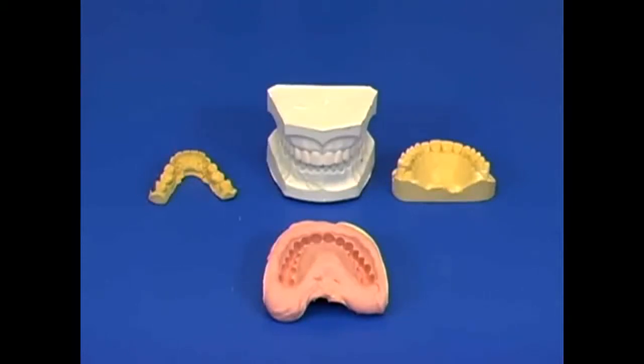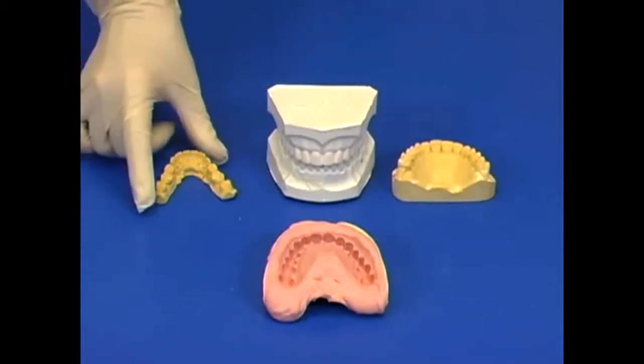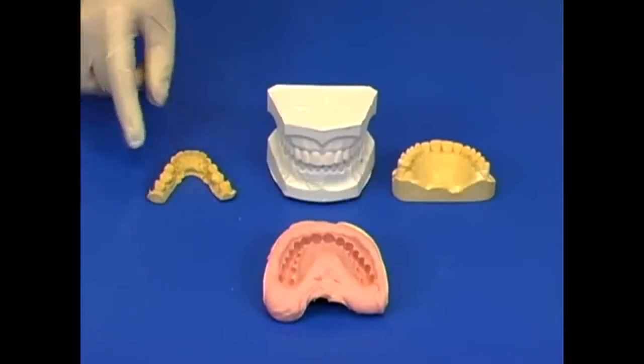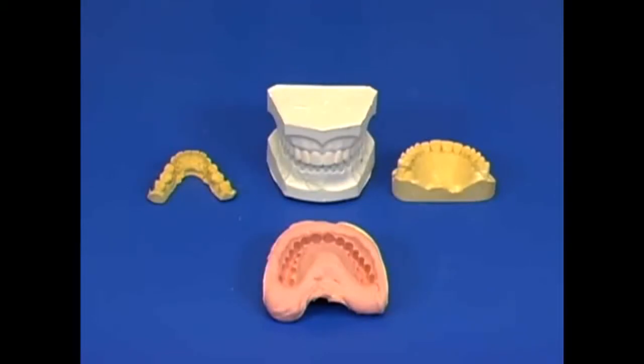I will demonstrate mixing dental stone and pouring a maxillary and mandibular impression without a stone base. These models can then be used to make bleaching trays or athletic mouthguards.